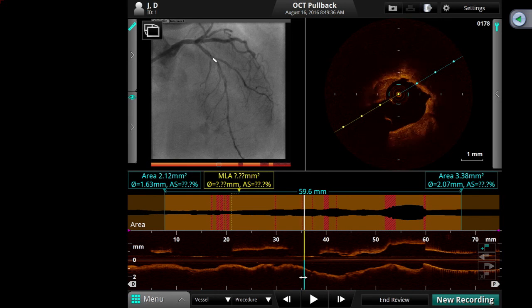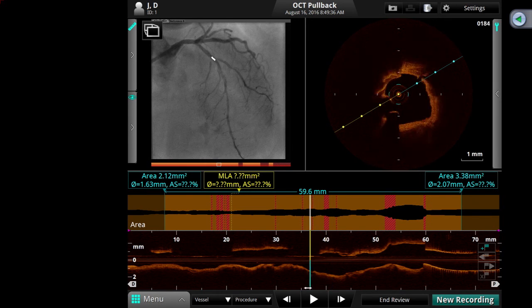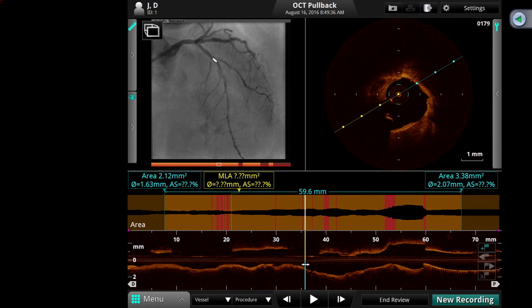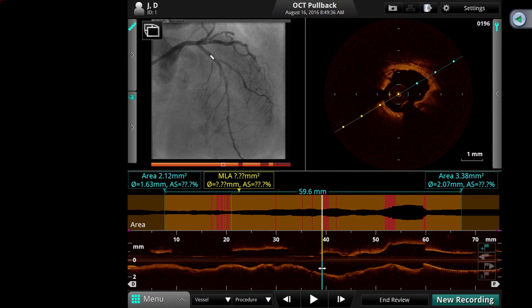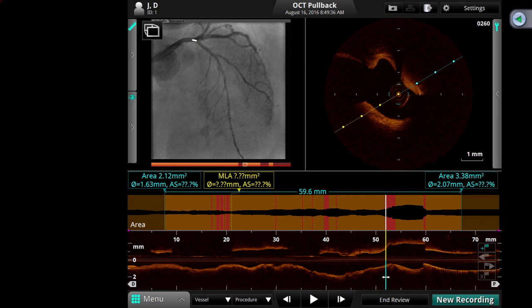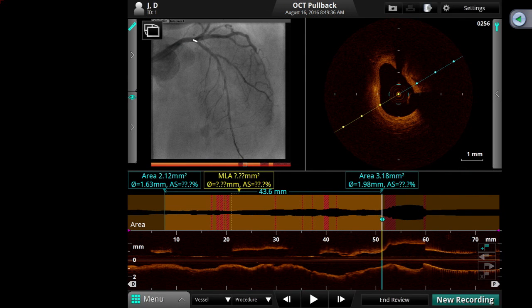But the lumen has nicely opened up. Yes. And what is the vessel size based on the OCT? Yeah, right there. That is exactly what I wanted, come back, come back. Yeah, give us that, right there. Get us a diameter. Based on what you have observed with the OCT, is there no reason for more lesion preparation?